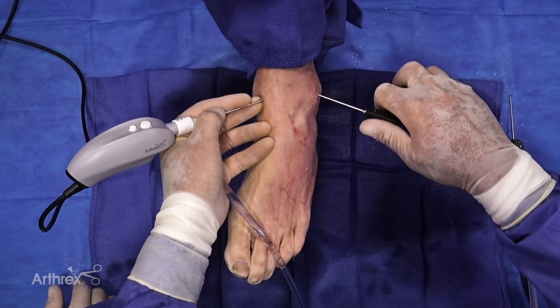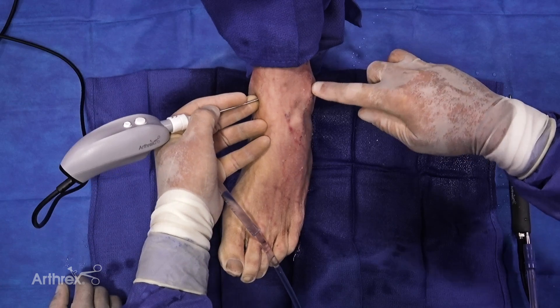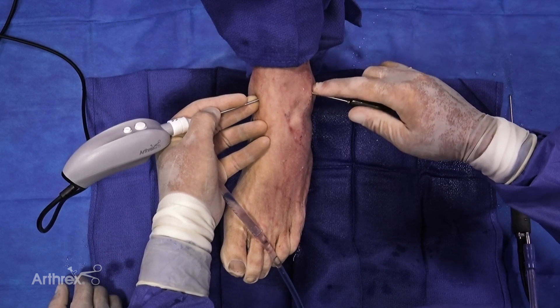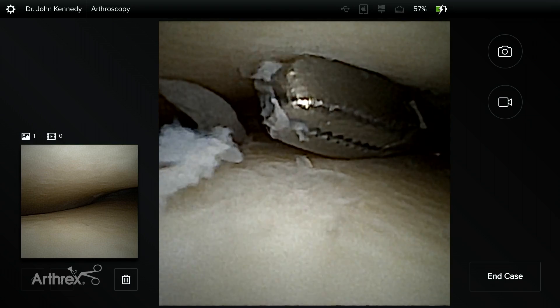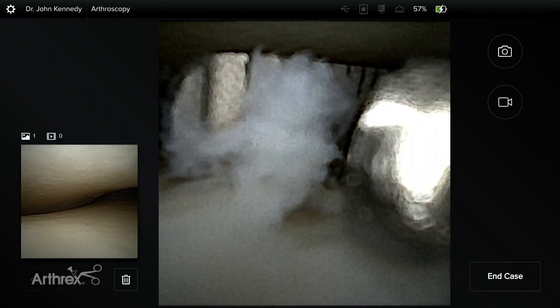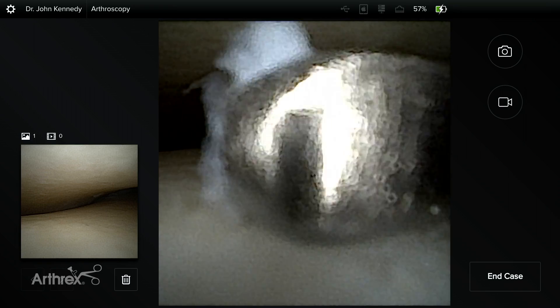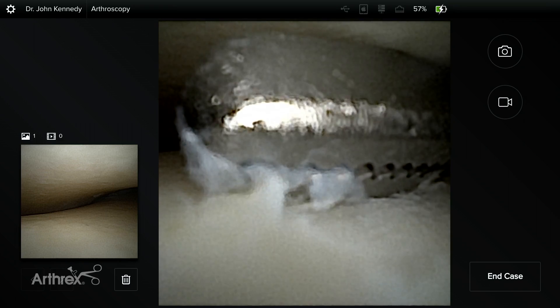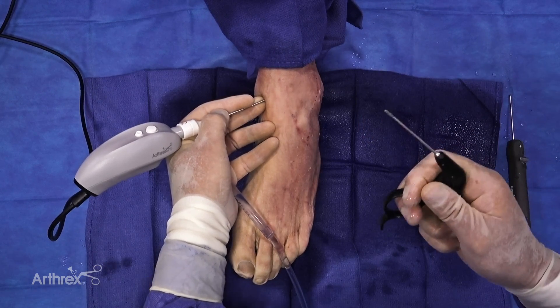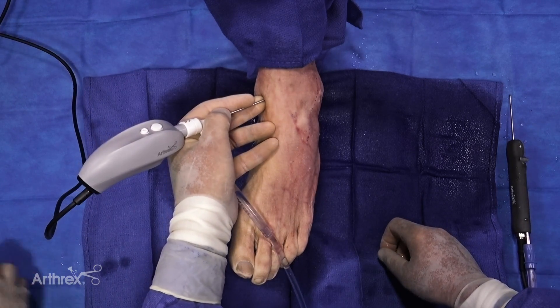In addition to the miniaturized Nano camera, we also have a portfolio of different smaller instruments. What we're using here for the purpose of demonstration is a two millimeter disposable single-use grasper. We're just going to grasp that little bit of chondral scarring there, and you can see how precise this is in its ability to pull off even a very small piece and pull it out without any difficulties. We have a whole range of these, including two millimeter biters and scissors as well as graspers.